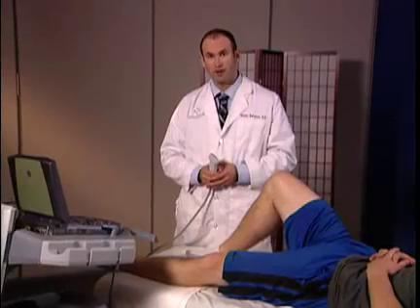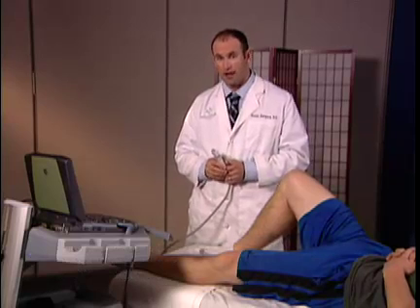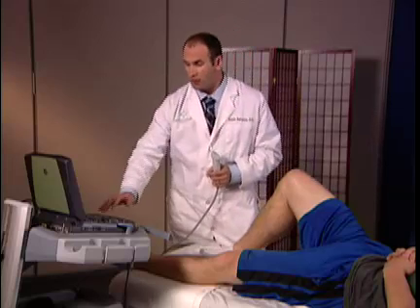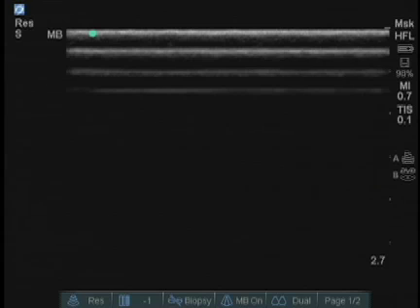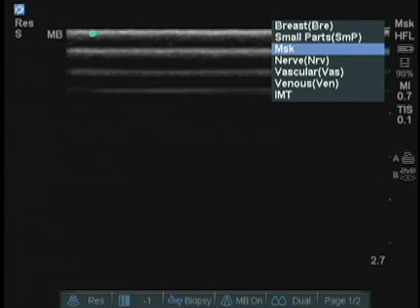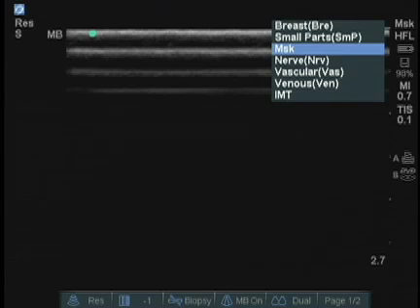We're going to review the knee exam, but before we get started, there are a few important principles to be aware of. Some of the ultrasound settings need to be taken care of before we do the exam. Firstly, we look to see that we have the machine set up for musculoskeletal. We do this by pressing the exam button on the machine, which will identify that we are in musculoskeletal mode. We will click select, and we're ready to begin.